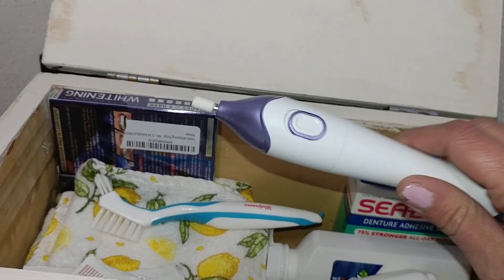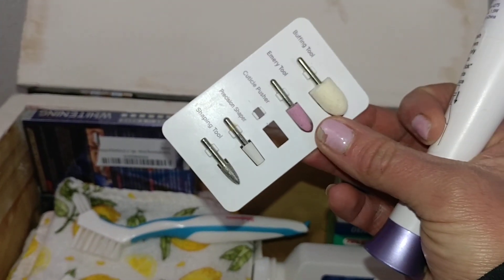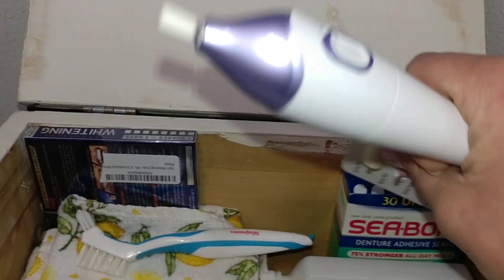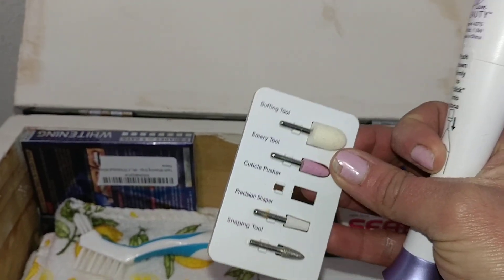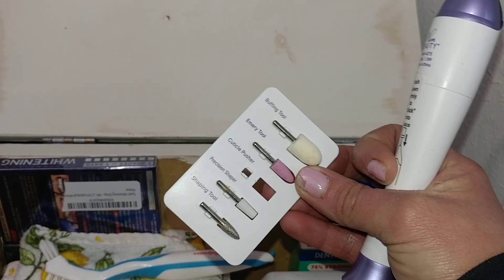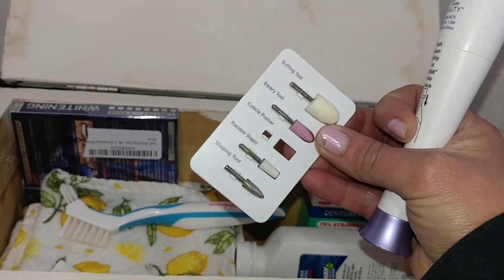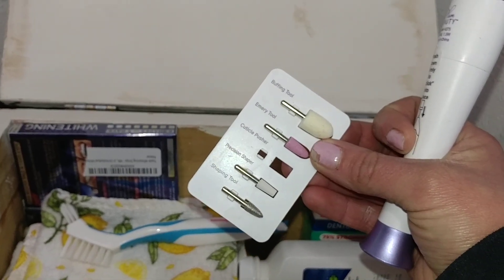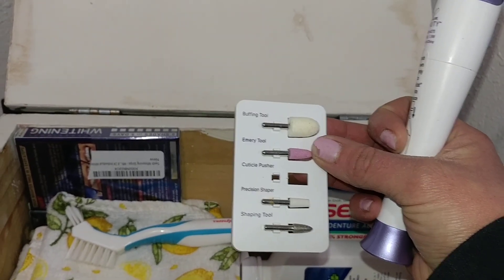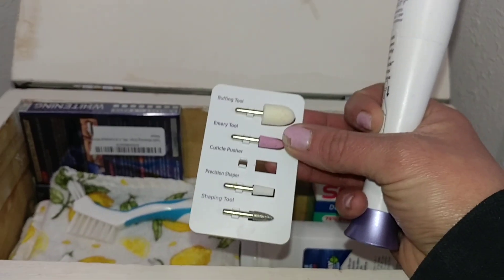Another thing post E-Day — I picked up one of these and it comes with some heads. It's like a Dremel, but for your nails. If your dentures are too tall or rubbing in a certain spot and you feel comfortable removing some of that material yourself, this came in really handy for me early on. And now, look at my nails — I can use it for my nails because they're getting kind of rough.